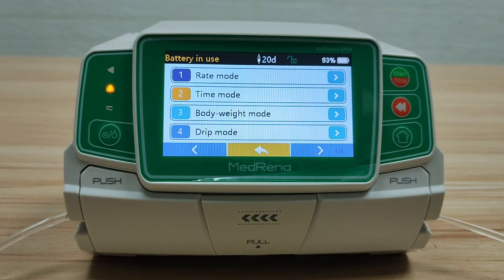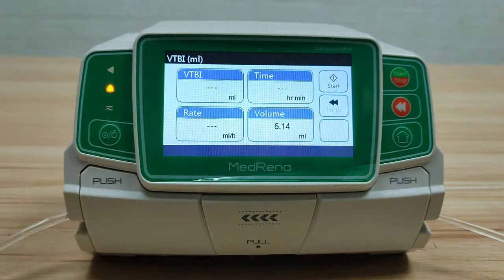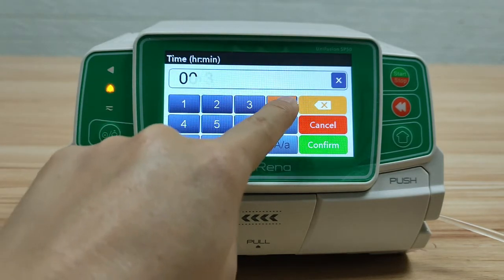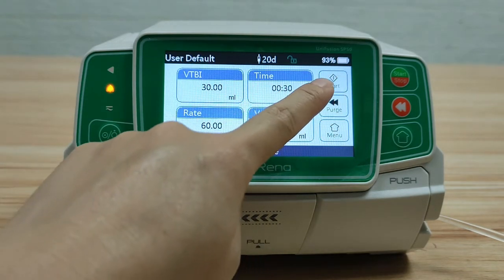The second mode is Time Mode. In this mode, enter the volume to be infused and the infusion time. The pump will automatically calculate the flow rate. Then start infusion.